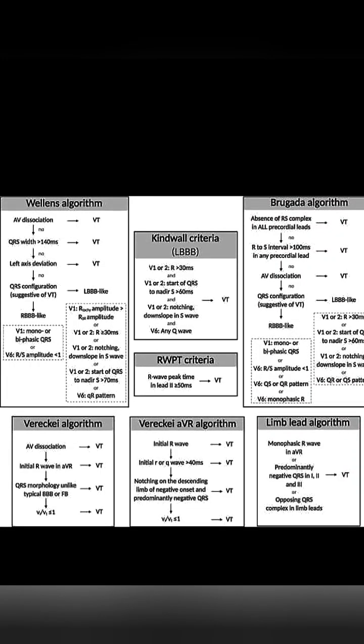Different algorithms for VT recognition: Vereckei, aVR, limb lead, Brugada algorithm, Kindwall criteria, and R wave peak time in lead II criteria.